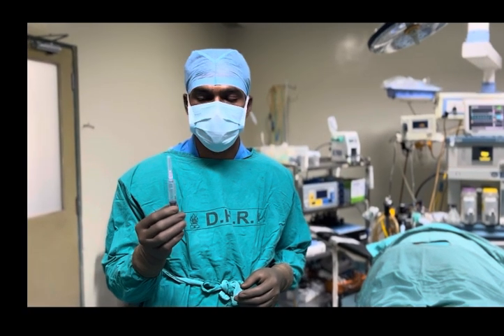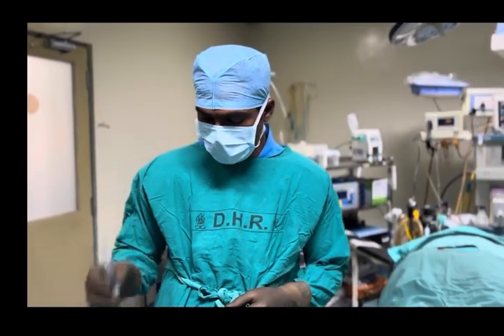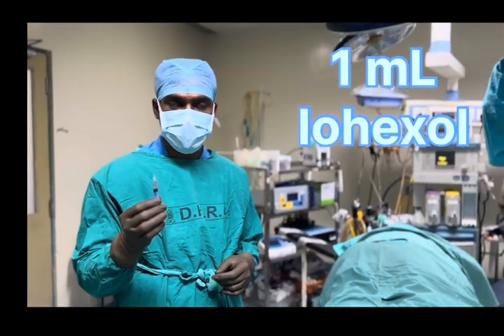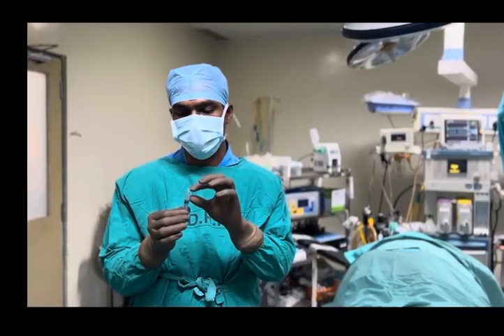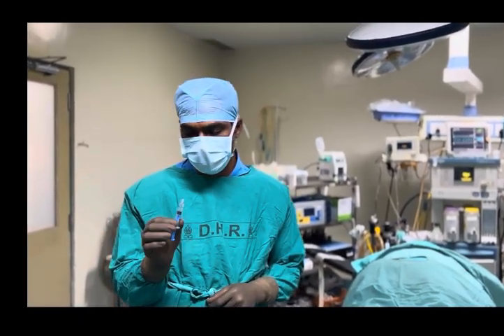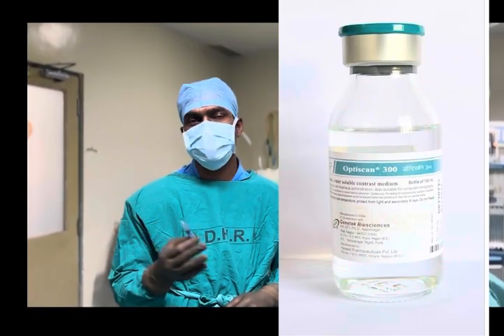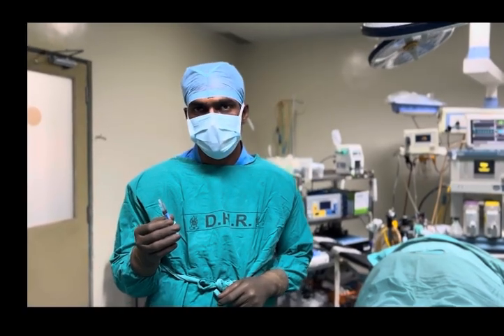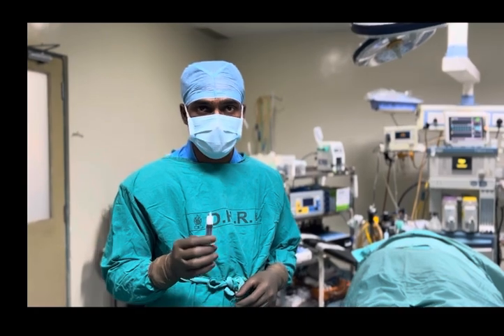The local anesthetic, we have taken lignocaine 2% in a 5 cc syringe. Then we need a radio opaque dye. This is an iohexol dye, and we have taken it in a 2 cc syringe, and the volume is 1 cc. We do not need this much volume also. We have taken 1 cc in this. The brand name of this is Optiscan 300, which costs around 354 rupees. And you can use this multiple times, and you can store that in your refrigerator in sterile condition.